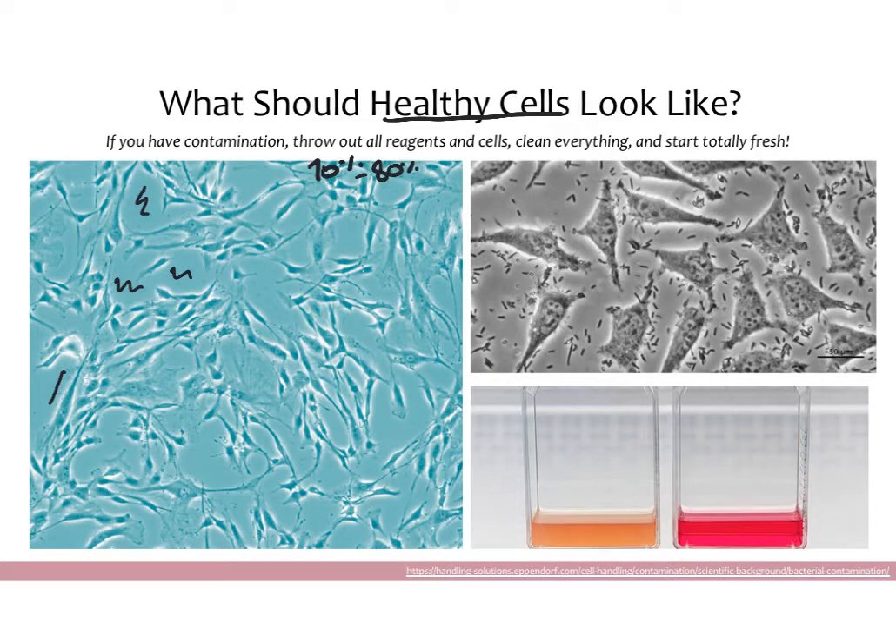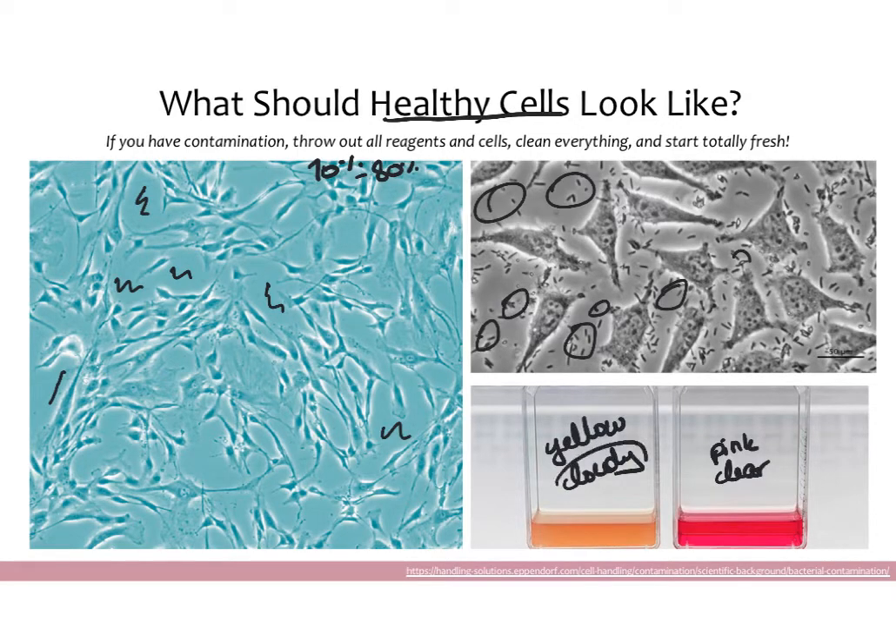If cells are under 30–40% confluent, you might just change the media and give them more time. On the other hand, if something is 100% confluent, you definitely want to passage it because those cells no longer have room to grow and will start dying soon. You also want to make sure your cells are not contaminated. Contaminated cells will show gross black dots in the background instead of a nice clean background, and your media will become yellow and cloudy. The cloudiness is the biggest indicator of bacterial growth — when bacteria grows in media, it becomes increasingly opaque. Media can turn yellow just from cells overgrowing and making it acidic, but cloudiness combined with yellow tells you the cells are definitely contaminated.